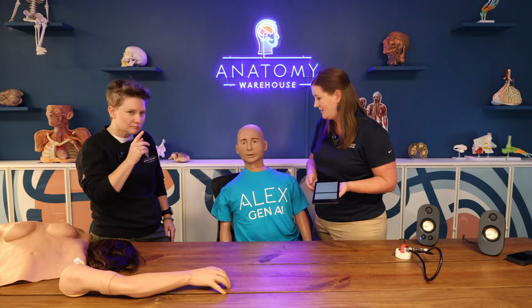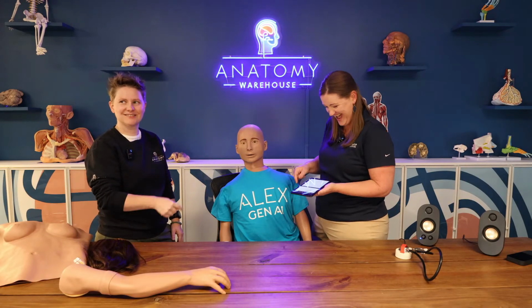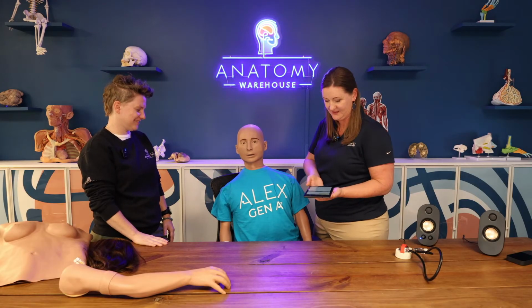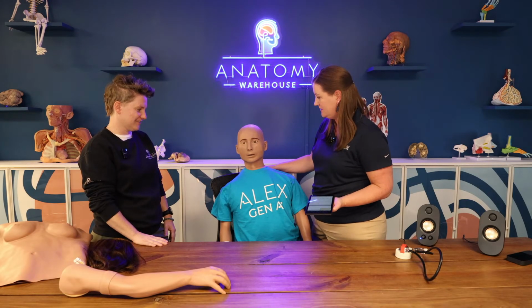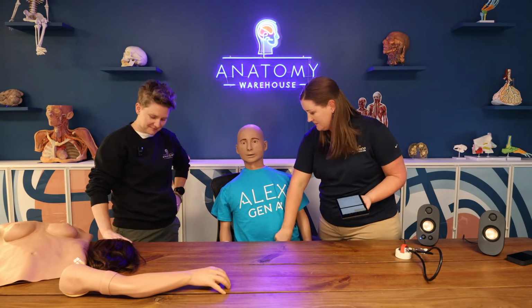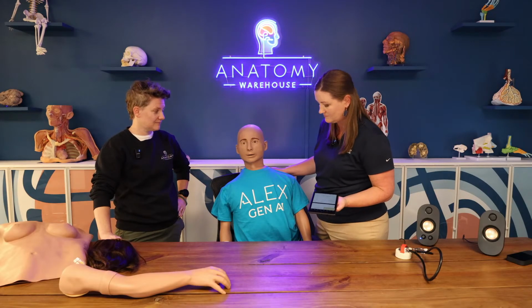Hi. Good afternoon. What's your name? Sorry, I didn't catch that. Could you please repeat? Good afternoon. What's your name? Good afternoon. My name is Andrew P. Landry. What brings you in today, Andrew? I was in a car accident and hit my head on the windshield. The police told me to wait for you.